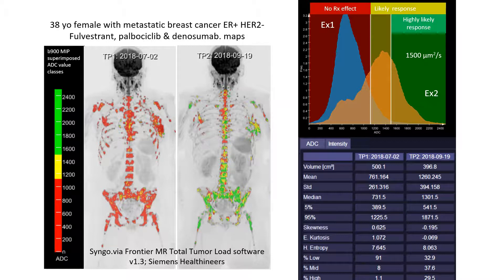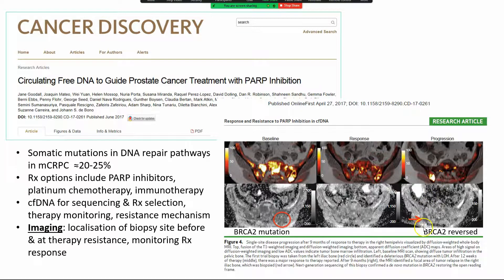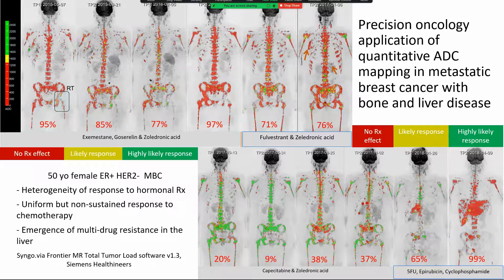Here is a patient in whom the left iliac bone showed high cellularity — high signal on diffusion, low on ADC — and there was a BRCA mutation. The patient was treated with a PARP inhibitor. You can see that the ADC increases. But on the contralateral side, we have an area of resistance that appears later, and in fact that was drilled and the BRCA mutation had reversed. So now you see the possibility for precision oncology using this technique. We use this technique to try to titrate changes in treatment before patients become symptomatic.